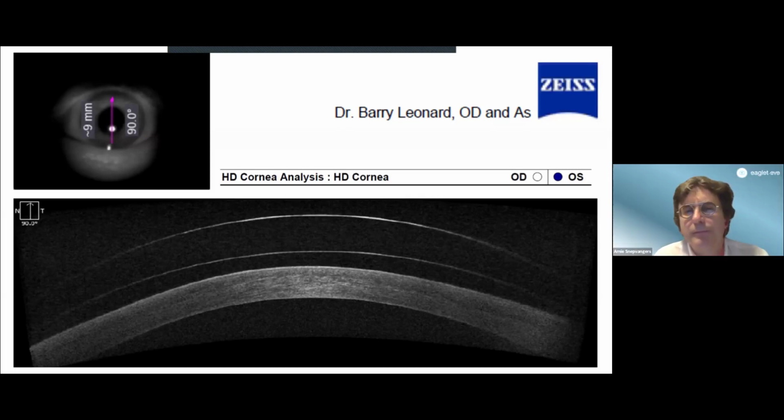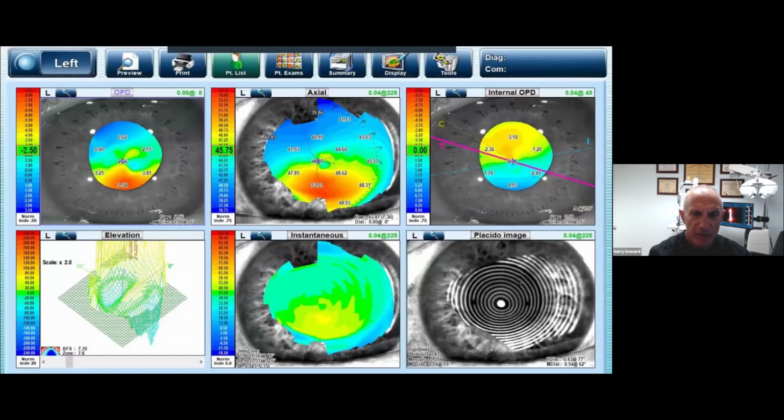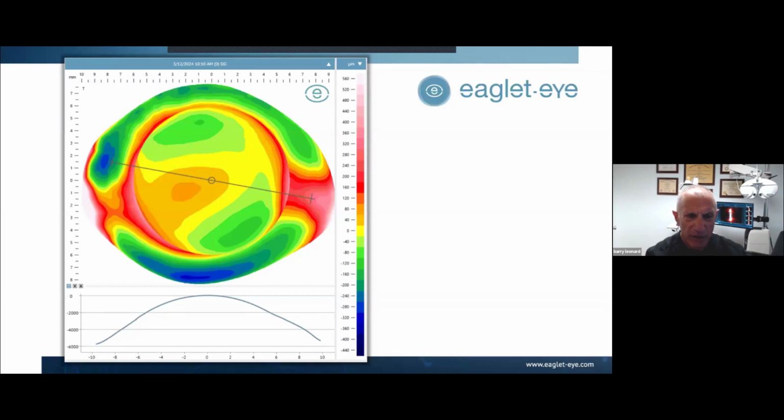Yeah, thank you. Okay. And the last great thing that we have is looking for lumps and bumps on eyes with profilometry. And here's a typical cone. But then we looked, and there's that big old Pinguecula. There's actually two on this eye. And as we know, well, Gianni, I think we could switch back to the live for a moment.